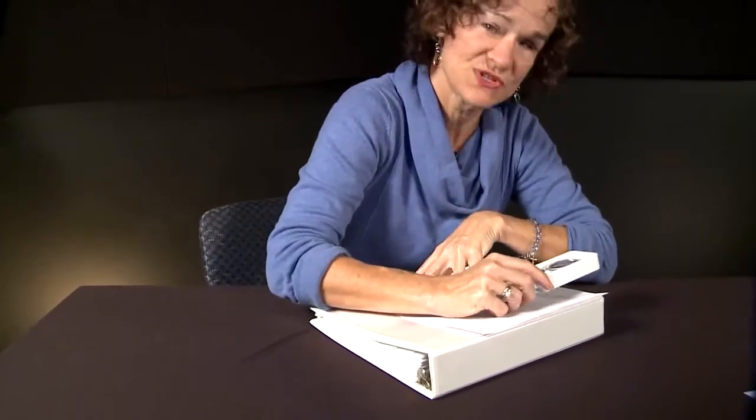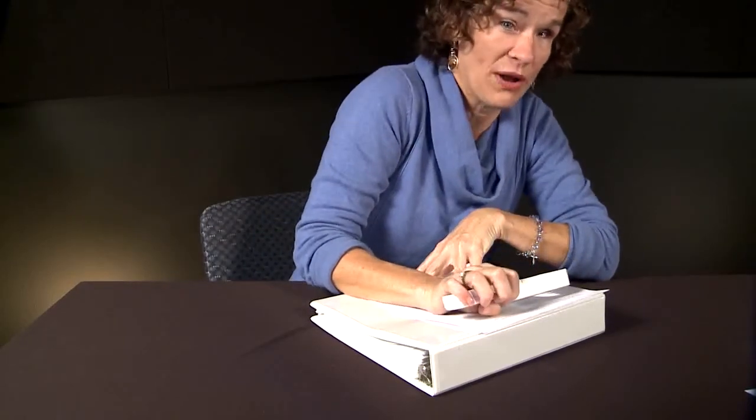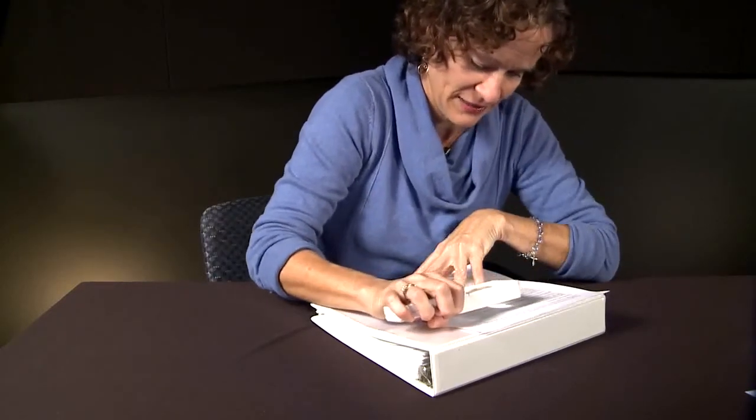So I'm going to demonstrate a couple of different options on hand position when you think about maintaining that focal distance. Again, it's moving smoothly across the line of print and using the base of a finger or edge of your hand, and then when my hand gets tired in one position, I'll just switch to balancing on my thumb and moving smoothly across the line.